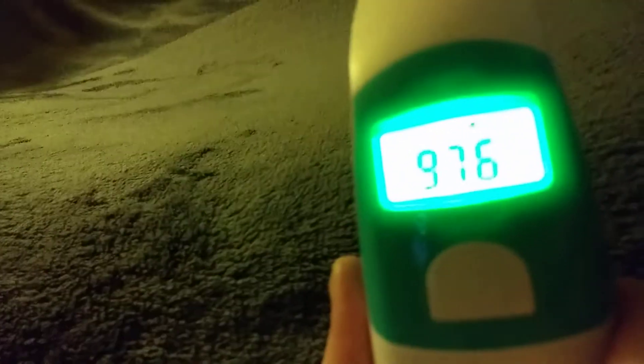So the thermometer is on — you place the tip of it on your forehead, in the middle above the eyebrows. Then hold down the measurement button in the front, and it does a long beep. 97.6 — that's very good.